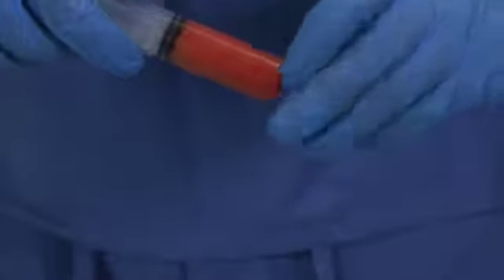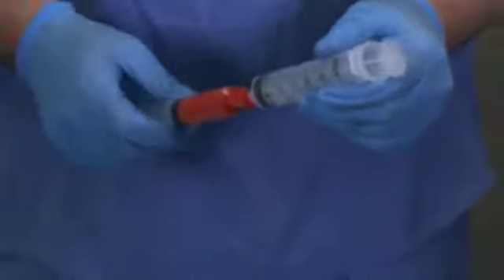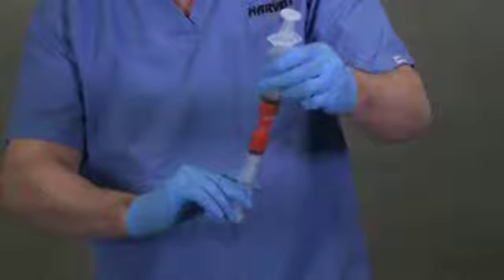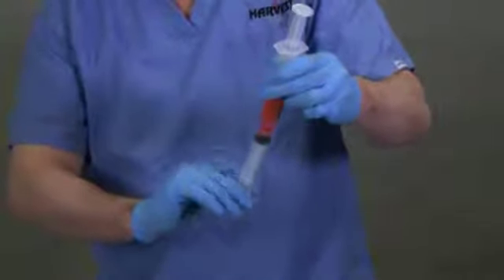Attach a female-to-female connector to the first collection syringe and connect to an empty sterile 30 milliliter syringe. Position the connected syringes so the collection syringe is on the bottom, vertical to the sample syringe. Expel the lipoaspirate solution into the empty wash syringe.